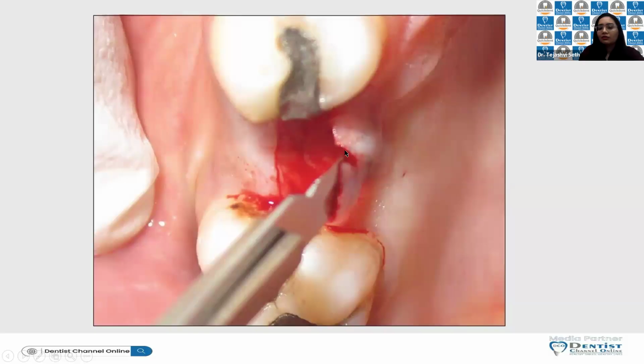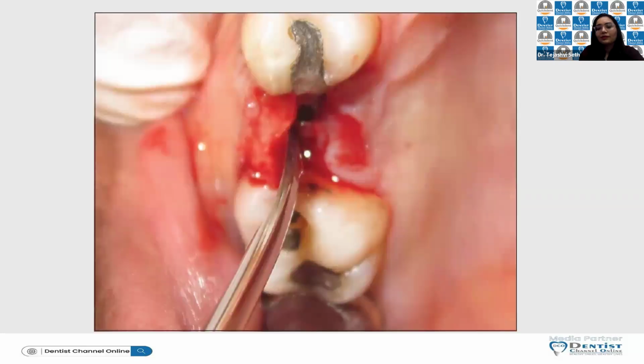See, this is basically your mid-crestal, not completely hitting the bone. The intracrevicular is, but your mid-crestal is again a bit superficial when you want to raise a partial thickness flap. I hope it is understood now.